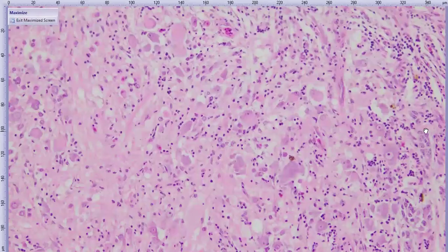So we have sort of a primitive neuroectoderm population and a disorganized neuroglial population. Together that gives us our diagnosis in this case, which is teratoid medulloepithelioma, kind of a fun diagnosis. Basically, medulloepithelioma is that primitive neuroectoderm part, and then the fact that it's also making this kind of disorganized neuroglial stuff, maybe showing a pluripotent sort of presentation. We add teratoid up top.